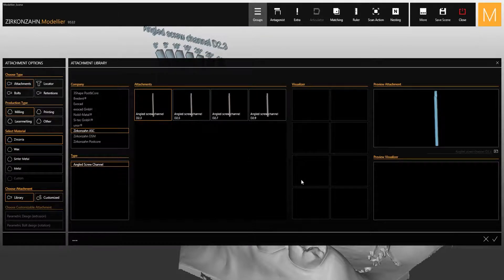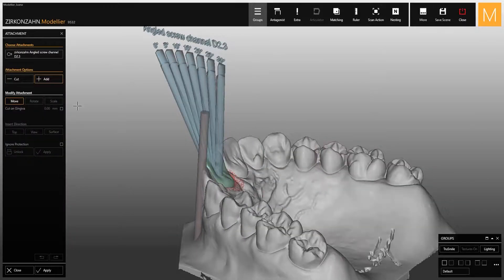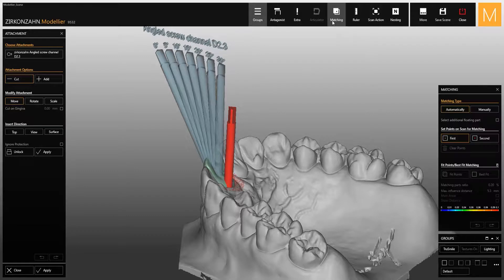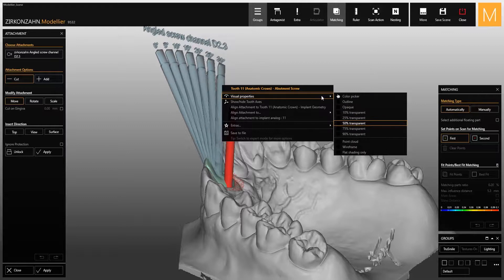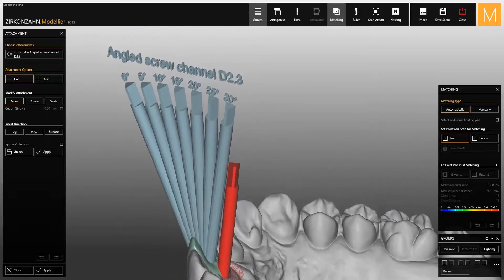After that, confirm the selection and place the attachment, making sure to activate the cutting mode. Since it is important to match the attachment precisely, select the matching function and proceed with the placement. To view the screw channels more clearly, right-click on them and select view properties, then choose flat shading only.